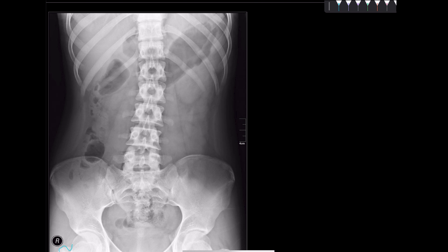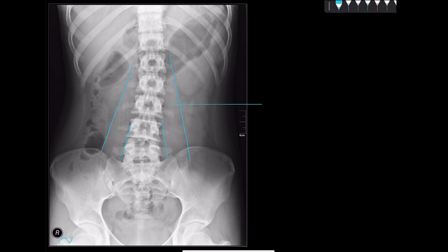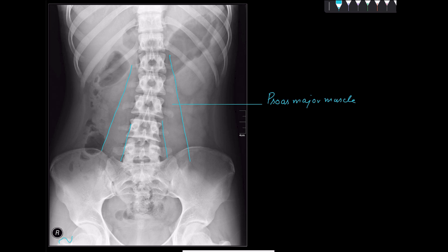Now I would like to show you another very important landmark. Whenever you are looking at any x-ray abdomen, never ignore this part. Can you see this obliquely going line? That is nothing but the psoas major muscle. This is a very important point, and whenever we are commenting on any x-ray, we should be looking for this muscle.